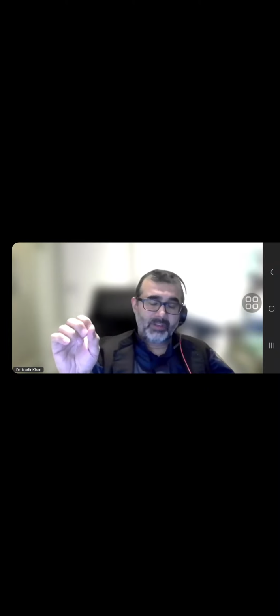Thank you very much. Just in continuation of the same, when you say large field of view, you mean when looking for the source of infection? Usually we can target the limb at least, whether it's upper limb or lower limb, and then we'll do big field of view scans through that limb. And once we find where the problem is, then we target that area. But I can't remember in the last 6-7 years having a patient where we did not know where the source of infection was and we did a whole body MRI. We haven't done that yet.